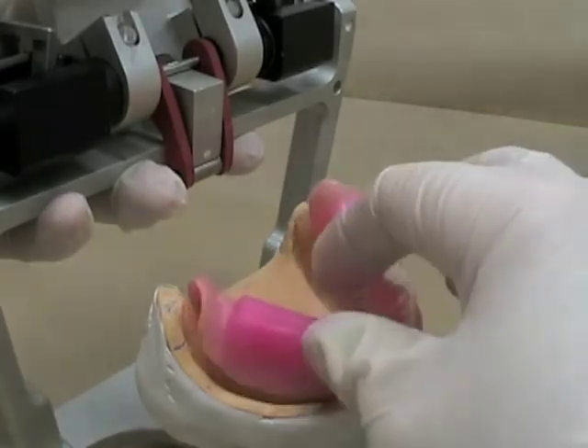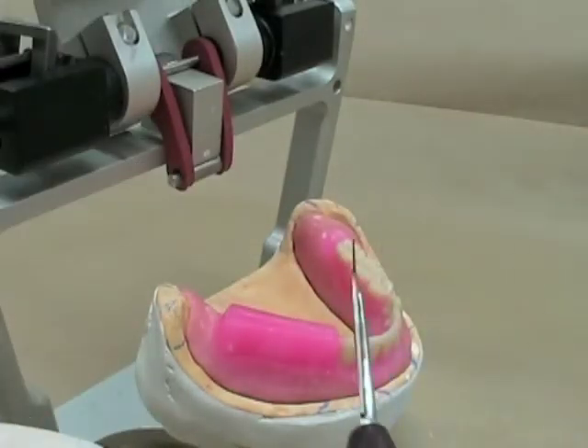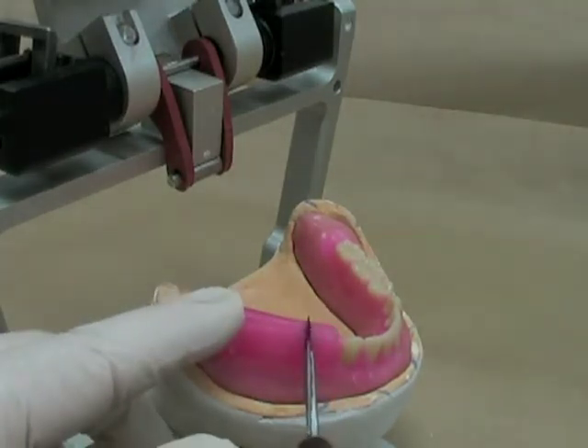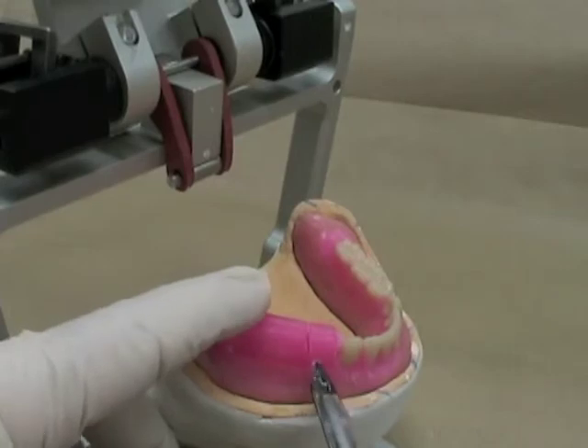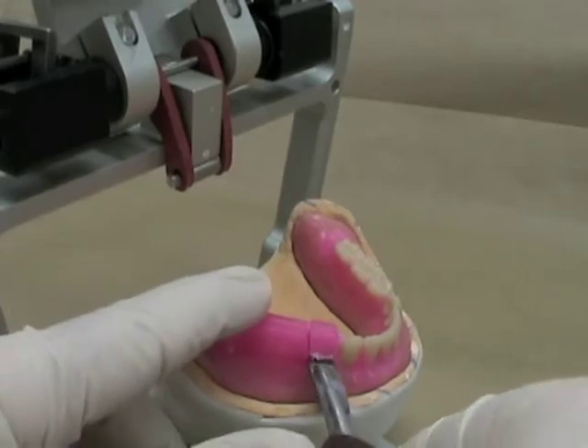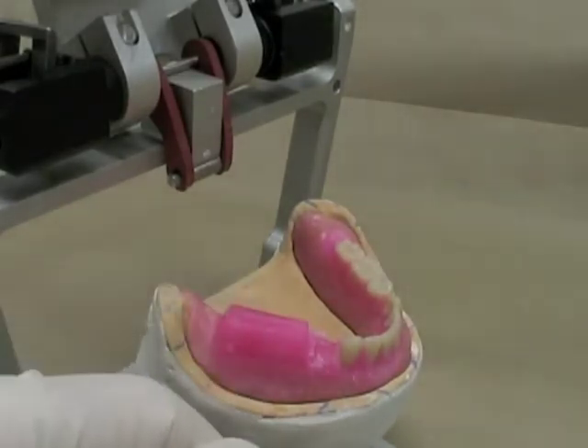We don't want to do that because tilting, tipping, and sliding of the denture can result. To set the mandibular posterior teeth, I just take away the wax — very similar to what I did previously for the anterior teeth — and make that area molten where you're going to put the tooth in.